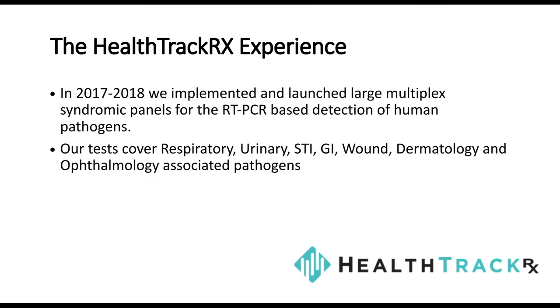So what was our experience here at HealthTrackRx in developing some of these LDTs? It was somewhere towards the end of 2017 when we launched our large multiplex syndromic real-time PCR-based test panels that cover a wide variety of tests with respect to respiratory, urinary tract, sexually transmitted infections, gastrointestinal, and wound, dermatology, and ophthalmology based infections.